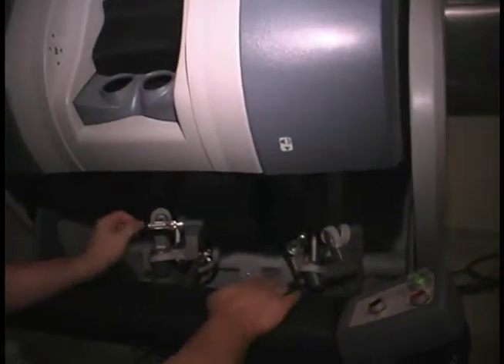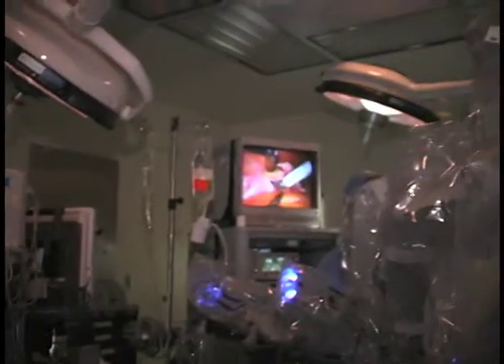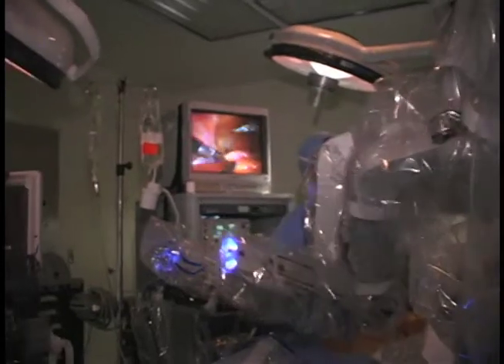The machine has four arms — three working arms and an arm that supports the camera and supports the lens.